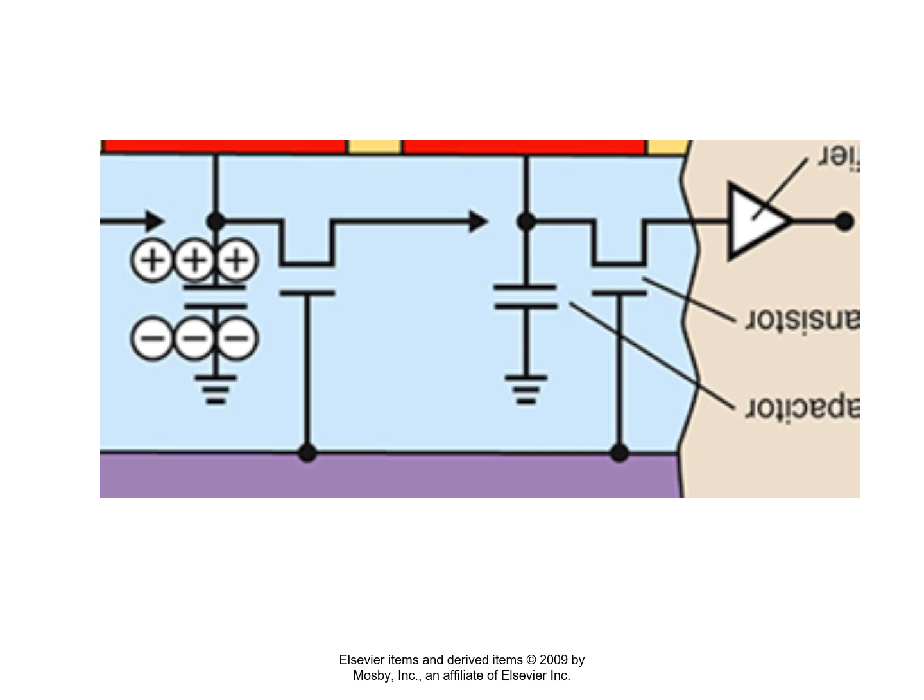And then the Coulomb force on the positive charges will motivate them to move away from the measly 3 negative charges and move toward the 5 or 10 or whatever more negative charges on the gate electrode. And so that's how we get those positive charges to shift off of the storage capacitor. But they won't do that until we supply a current to the gate electrode and stack negative charges on the gate electrode. Okay?